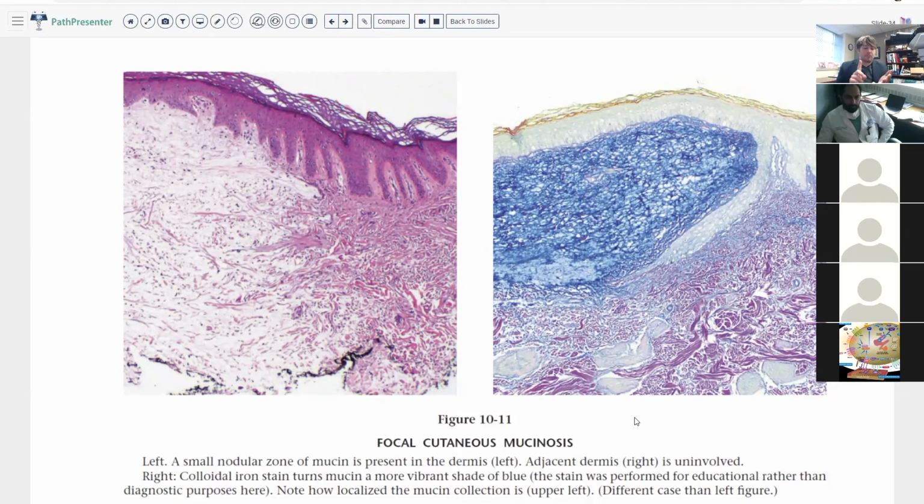If it's got prominent vessels, if it's got neutrophils, now sometimes if this gets picked at or is ulcerated, it can get neutrophils, but or if it's the superficial aspect of a larger, deeper lesion, then those are times where I might think more about cutaneous myxoma. Again, both lesions are benign, so the distinction is not that important, but there are times where we wonder, well, how do you make the distinction? And people have asked me that, so that's the answer. I don't know if it's a very scientific or good answer, but it's an honest answer.